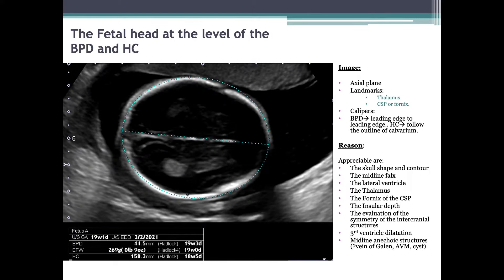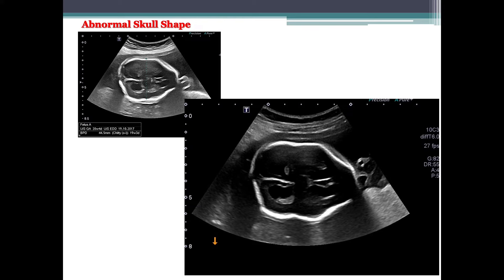The fetal head at the level of the BPD and head circumference: in a true axial plane, the biparietal diameter should be measured at the level of the thalamus demonstrating midline falx and the CSP. This one image depicts a plethora of anatomical structures that must be evaluated, including skull shape and contour, midline falx, lateral ventricles, thalamus, fornix of the CSP, insular depth, symmetry of intracranial structures, any third ventricle dilatation, and midline anechoic structures — thinking about vein of Galen, arteriovenous malformations, or cysts. Here we have an example of an abnormal skull shape seen in a fetus with a significant neural tube defect.